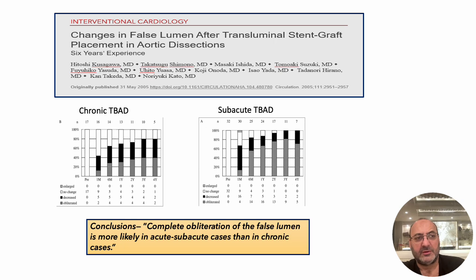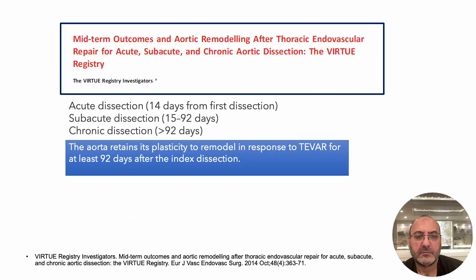Today we're doing laser septectomies and things like that. These septums are very thick, and sometimes we stent and just use the false lumen as a conduit. So the false lumen becomes very rigid, sometimes very big, or the septum between the false lumen and the true lumen becomes very hard to break.